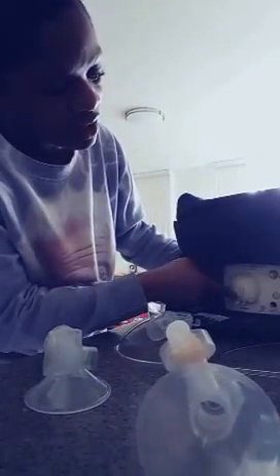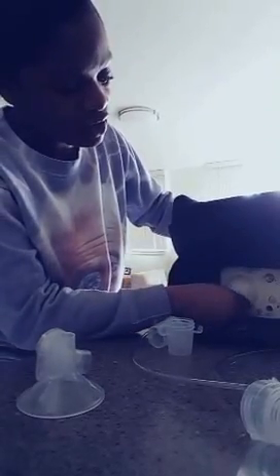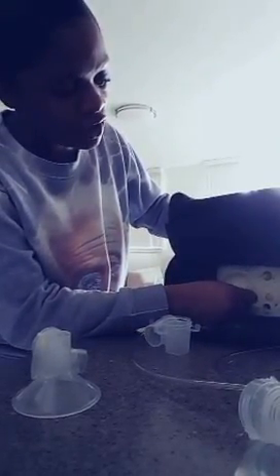And so there's two sides, one side for each. You can choose to use just one side, and you close it off with the stopper. So once everything is connected, you can choose to use either the left side, the right side, or both sides. Today, we're going to be using both sides, as I have to get ready to pump a bottle.